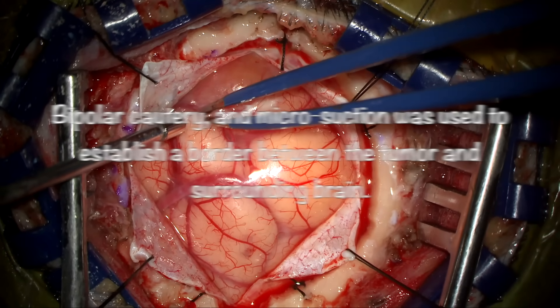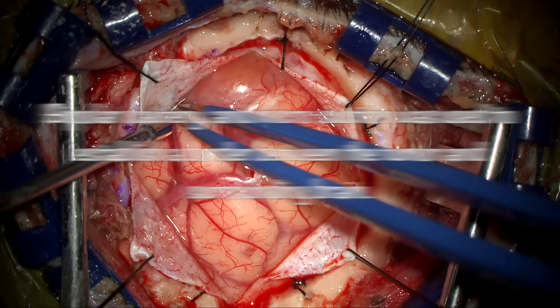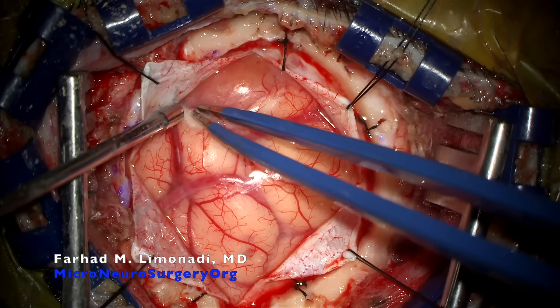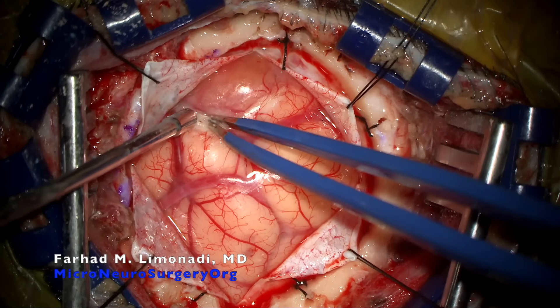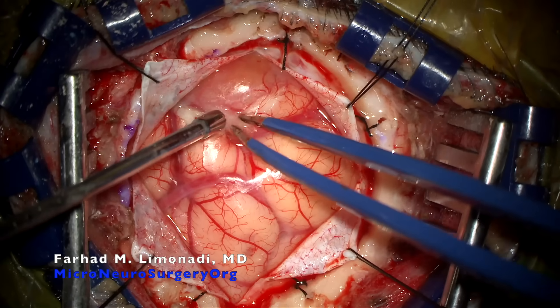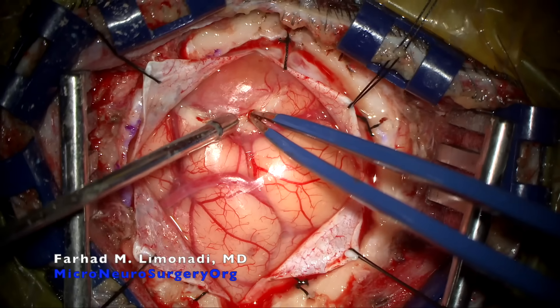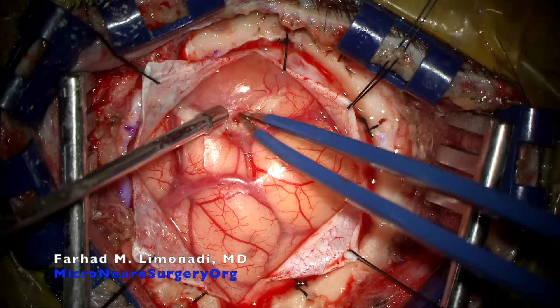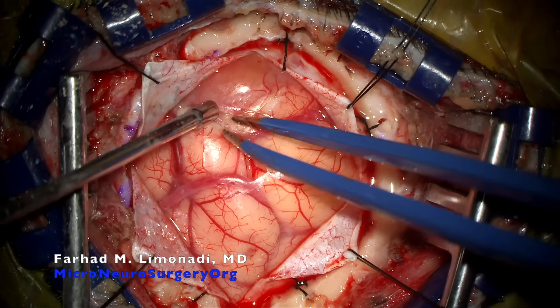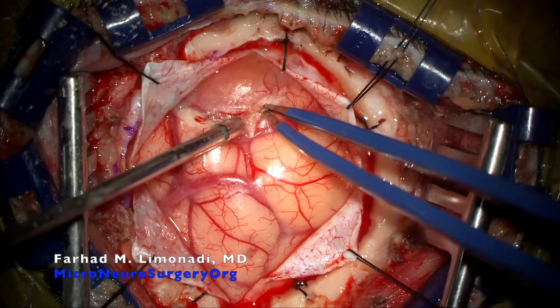Bipolar cautery and microsuction was used to establish a border between the tumor and surrounding brain.